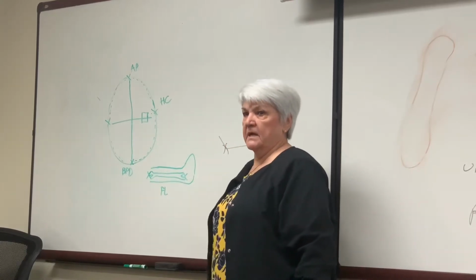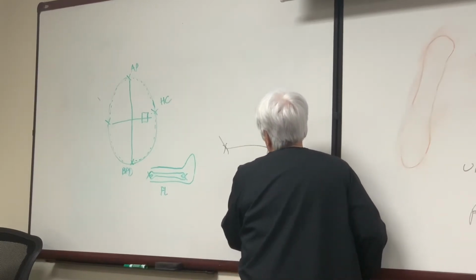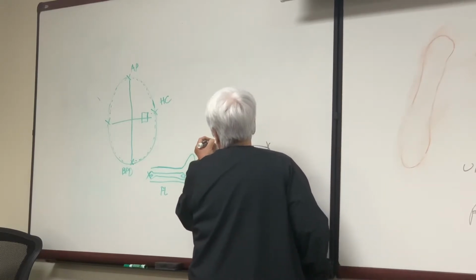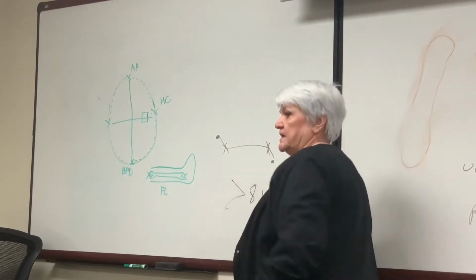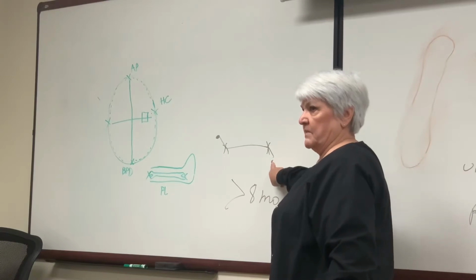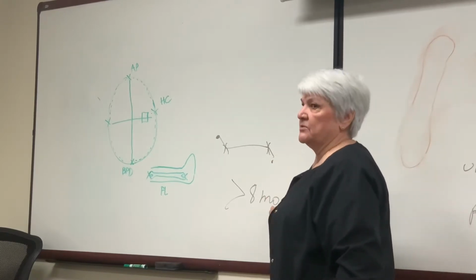Inside. Okay? If you come down here and you see an epiphyseal, little dots, this baby's greater than 8 months, especially the distal epiphysis. Okay? If you see this, we know that baby's greater than 8 months.